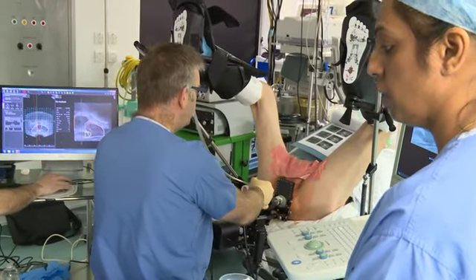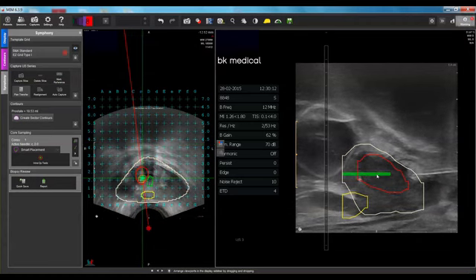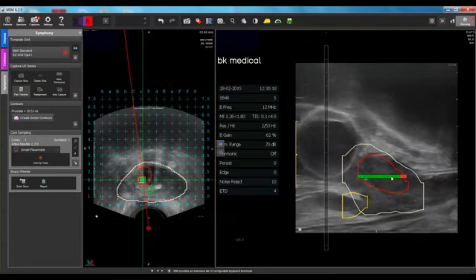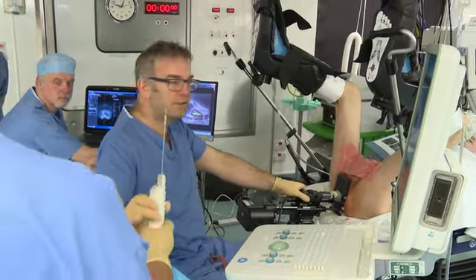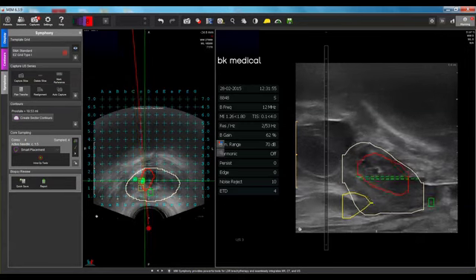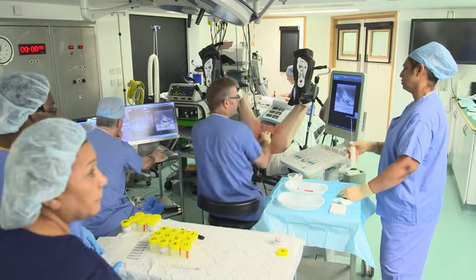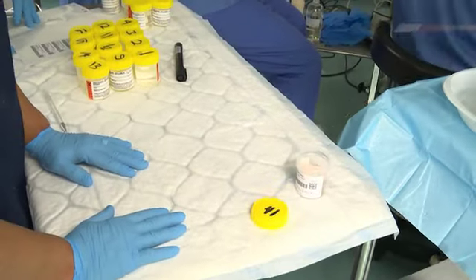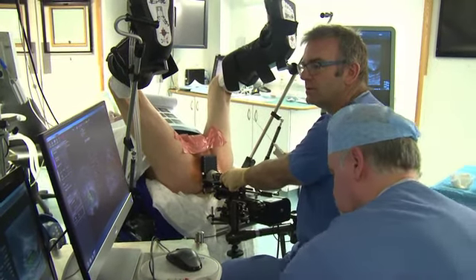So I'm just coming to the right of the midline. We can see the needle coming in there. This is the middle, and I could feel resistance in the deployment. This is hard tissue. Oh yes, we got a good bit of tissue, yeah. Okay, so we're coming in to capture the lower component of the tumor. That's good, that's excellent. So I'm going to try just to capture that bit of the tumor that we haven't yet captured. Okay, this would be impossible to do without registration.